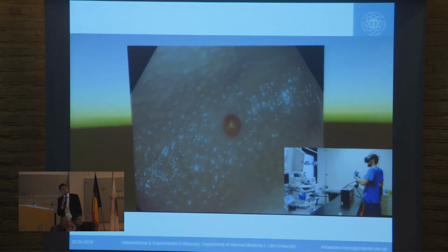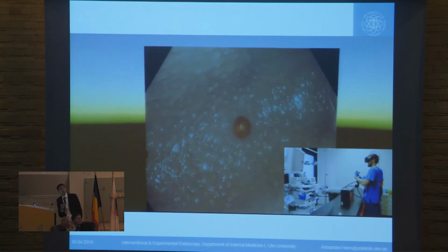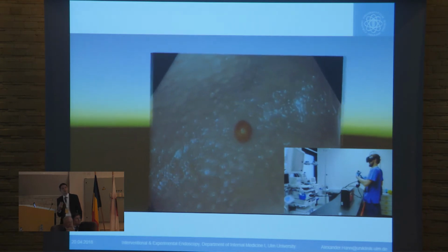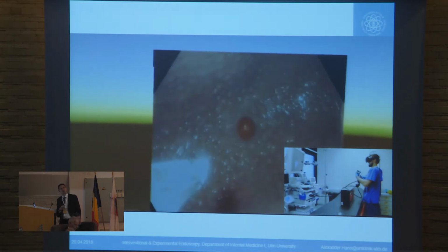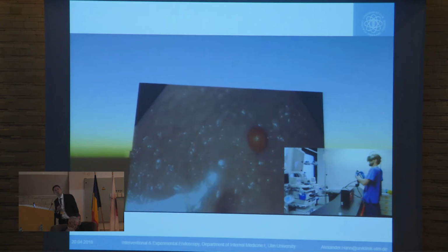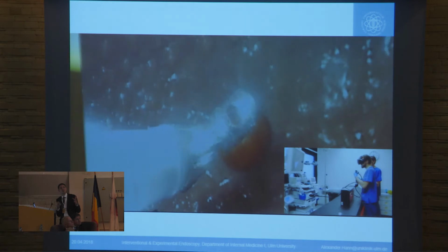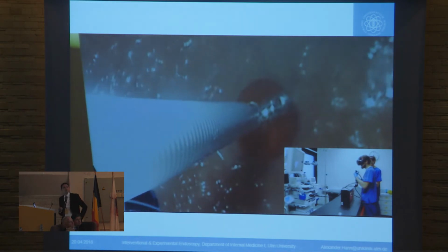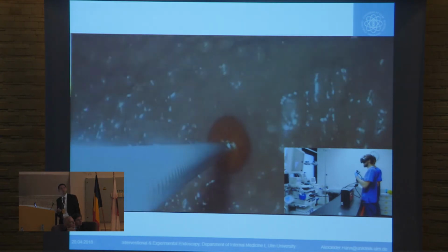This is a more complicated biopsy because he's pretty far away from this polyp. So again, this zooming comes into place. When he wants to perform the biopsy, he just needs to lean forward, and the image size gets bigger, so he can perform long-distance biopsy. So this is just a short example of what this new technique might help us to do.